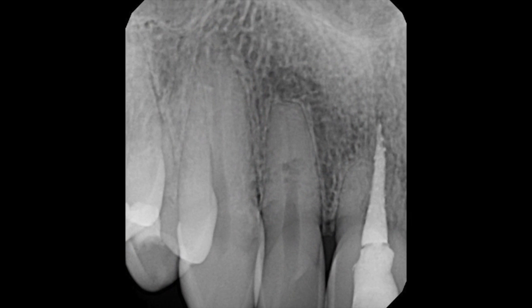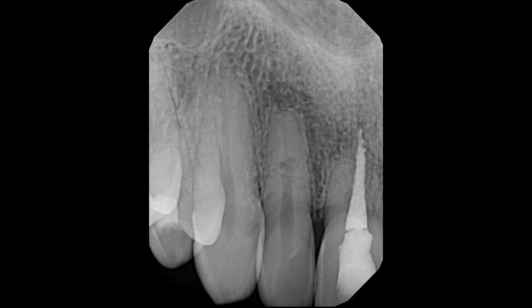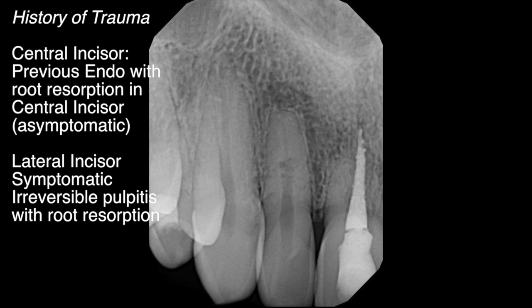After that overview, it's time to get into the video and demonstrate the technique. Let's take a look at this maxillary right lateral incisor. This tooth has a little bit of a resorptive lesion directly on the buccal middle aspect. Upon testing, the tooth is presenting with irreversible pulpitis — the patient is symptomatic, and we're going to do root canal therapy. The patient understands that the resorptive lesion, if perforating, may require surgical intervention in the future.